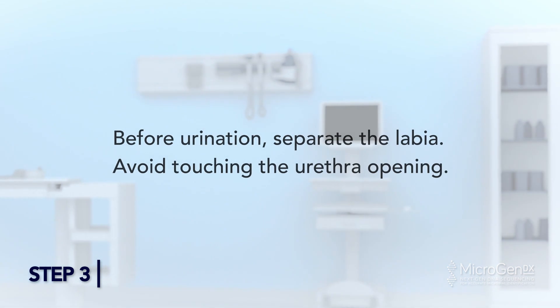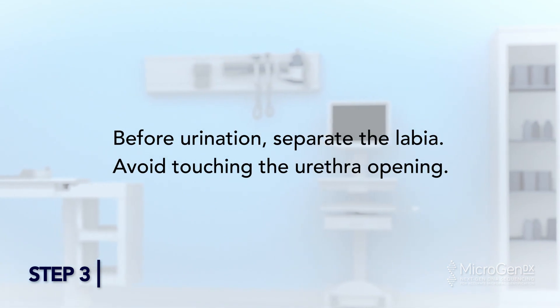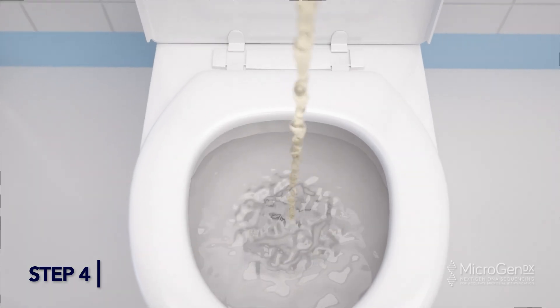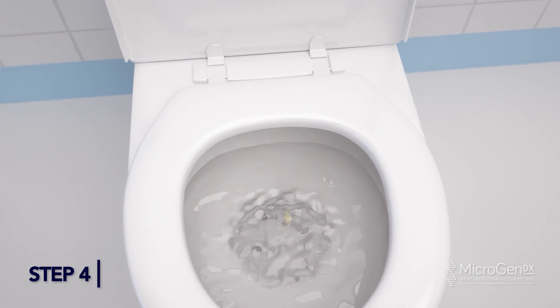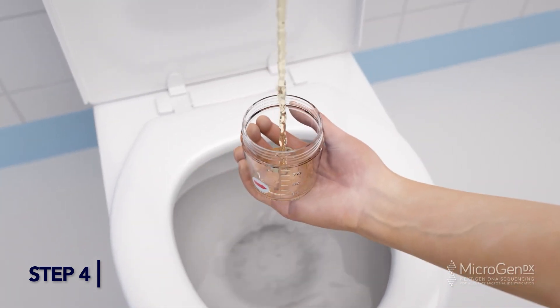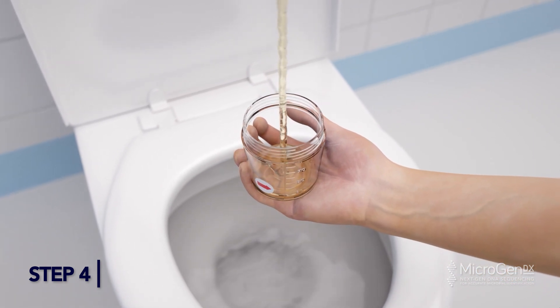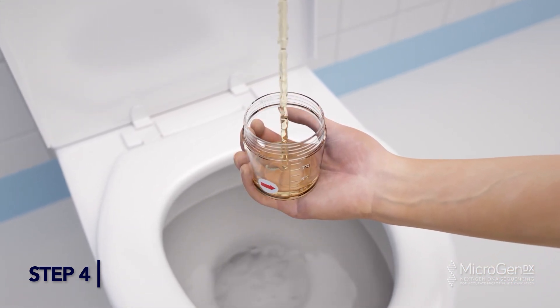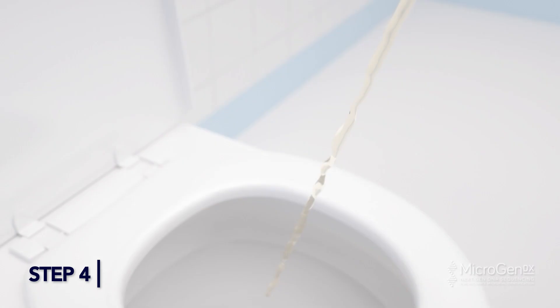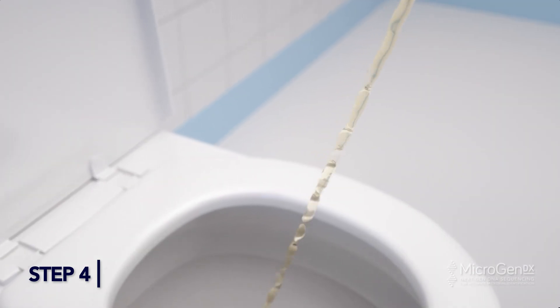Step 3: Before urination, separate the labia. Avoid touching the urethra opening. Step 4: Hold the empty cup in one hand. Begin urination into the toilet, not the cup. Stop urination part way through, then continue urination into the cup. Keep urinating into the cup until the amount is leveled with the red arrow sticker. Do not fill the cup more than half full. Finish urinating into the toilet.